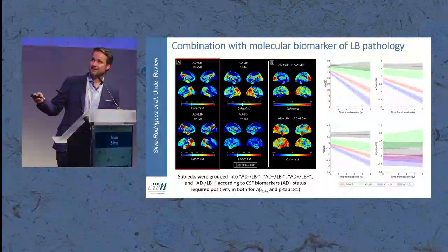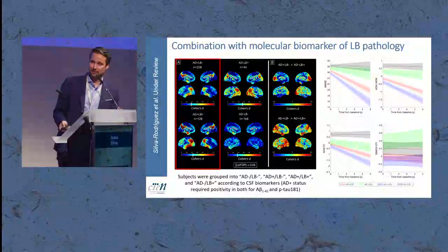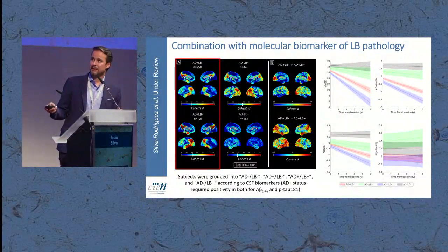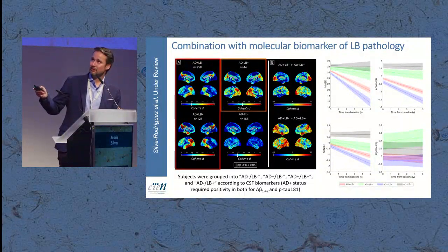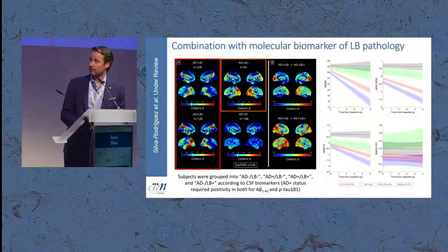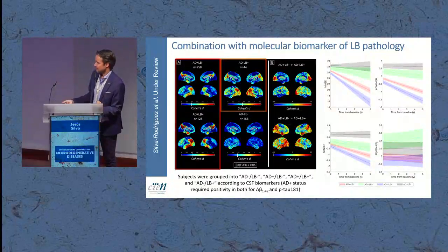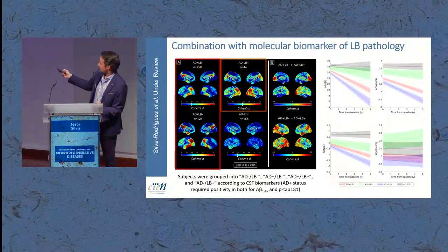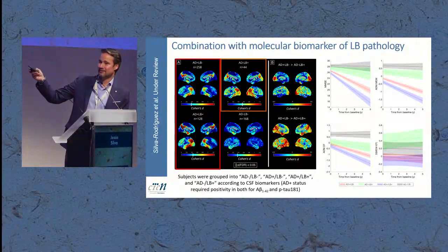So the exact same neurodegeneration pattern, with the very well-preserved occipital lobe in the mixed patterns compared to the patients with only Lewy body pathology, where we see this clear occipital affectation and spared medial temporal lobe. Just to complement the result that David already showed us with LATE, we can see that the blue line corresponding to the mixed cases, they are faster progressors than the cases only with AD.